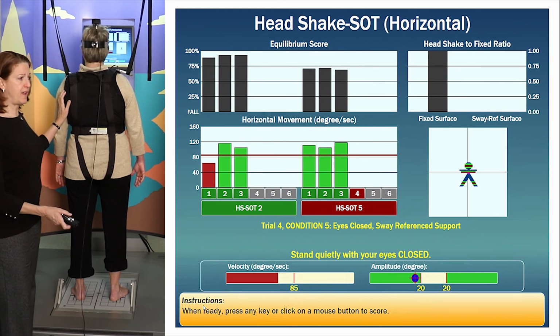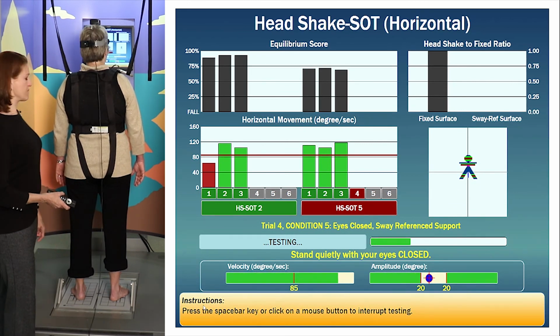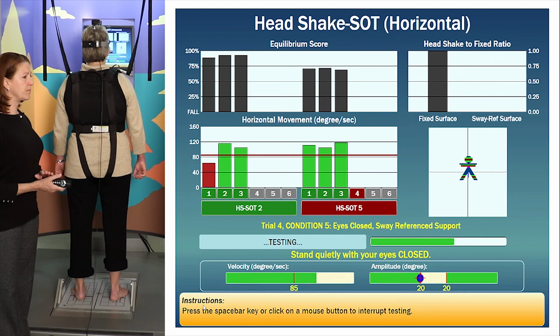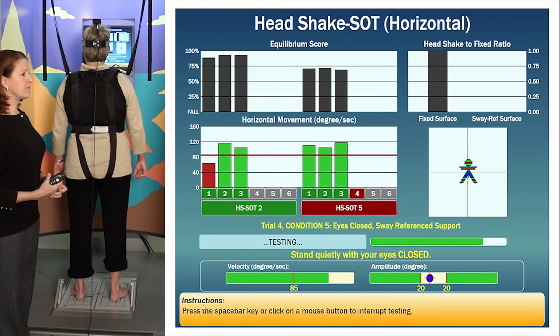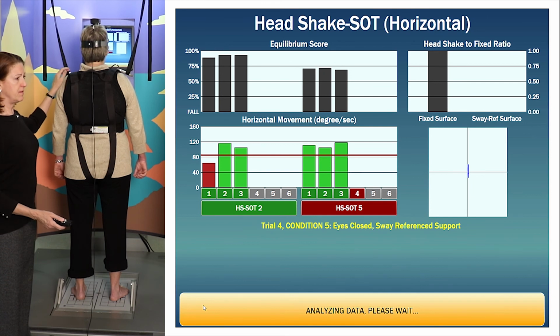Close your eyes and testing. Good job. All right, stay right there.